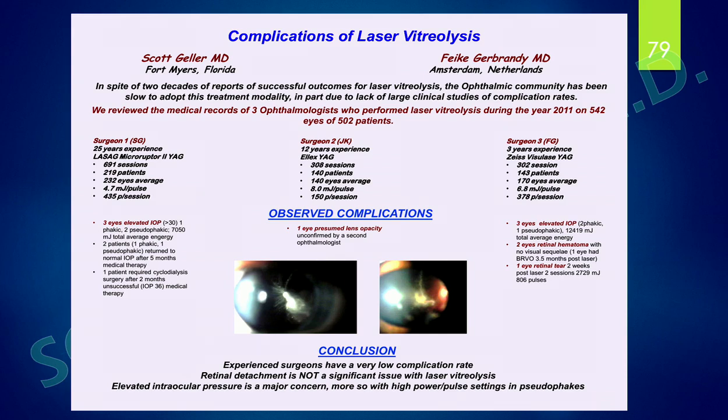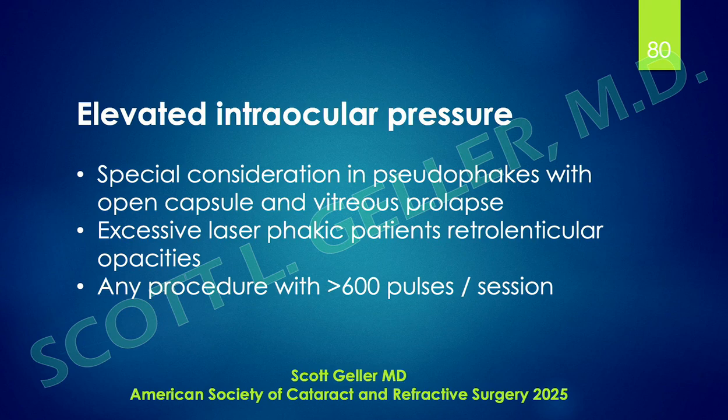No retinal detachments. Elevated intraocular pressure is the most serious thing that you might see, at least in my practice, that I've seen. So knowing how to avoid that's very important. So elevated intraocular pressure, this can be very serious. The last thing you want is a patient coming in for a simple opacity and having a potentially blinding procedure done. So what do you have to be concerned about here?